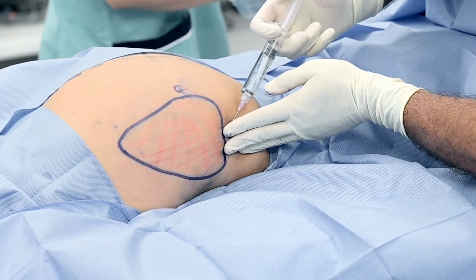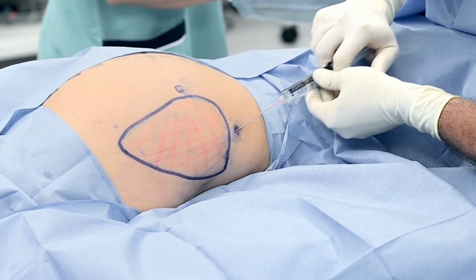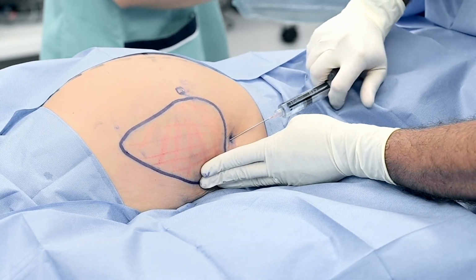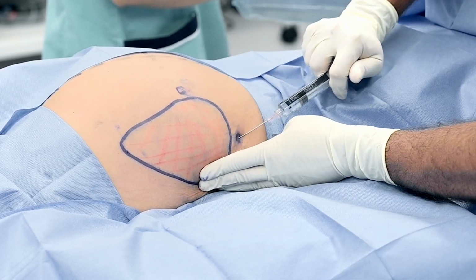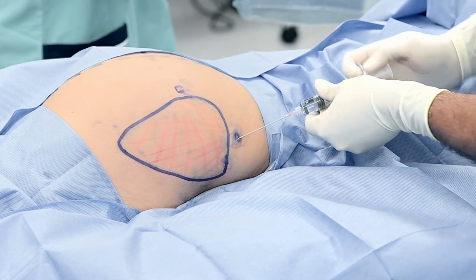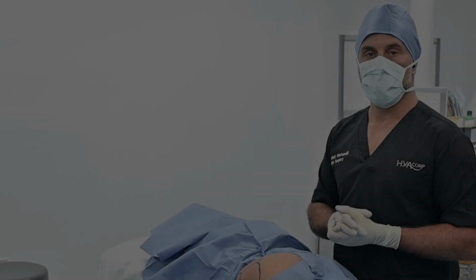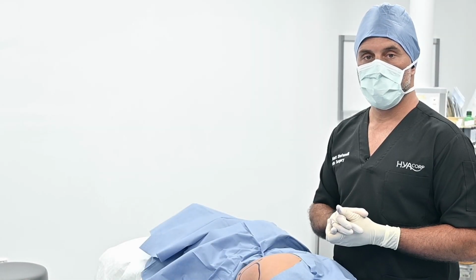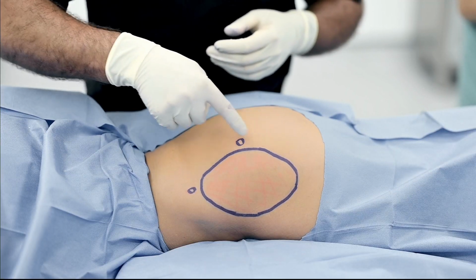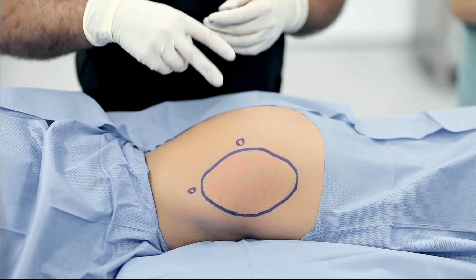And this way I can inject now perpendicular to my previous injection, both deep like this. So we are ready now to inject the second side, the left side. Again, you see here the markings, the injection zone and the two entry holes.